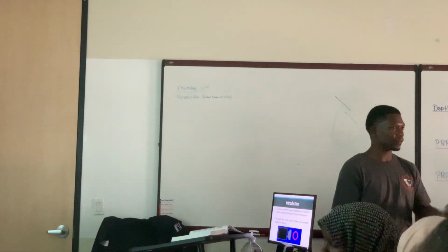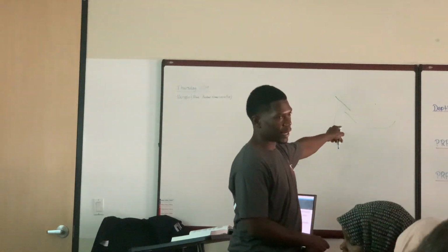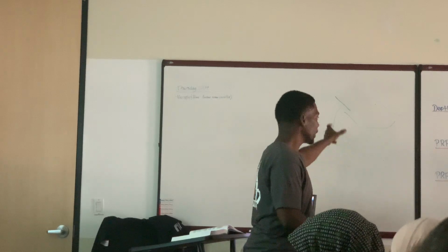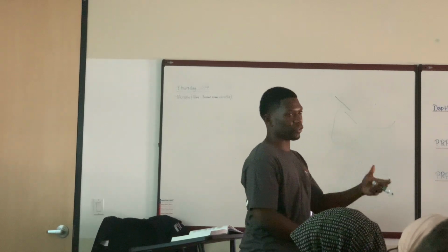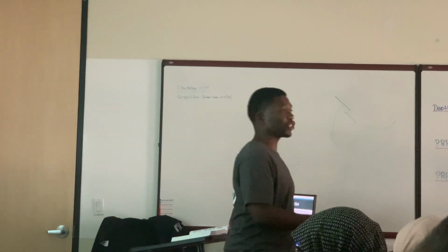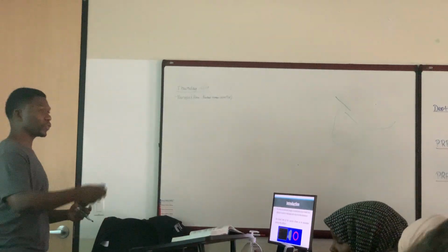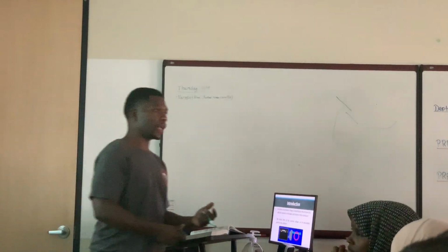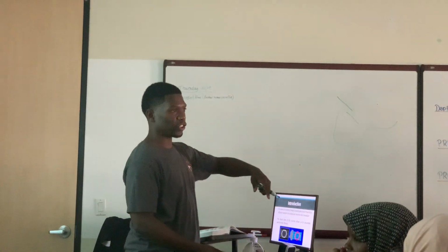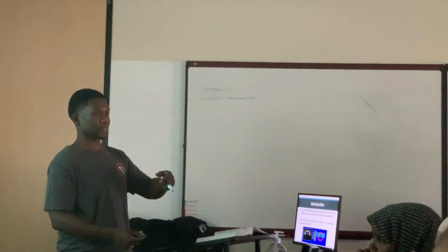It may not be that large a difference; I'm drawing that for illustrative purposes. Remember we talked about refraction: it's not going to transmit in a straight line, because there are two different mediums that are so vastly different. Refraction is based on propagation speed and oblique incidence. The propagation speed of the needle compared to soft tissue is so vastly different that it's going to cause a refraction on top of the oblique incidence.